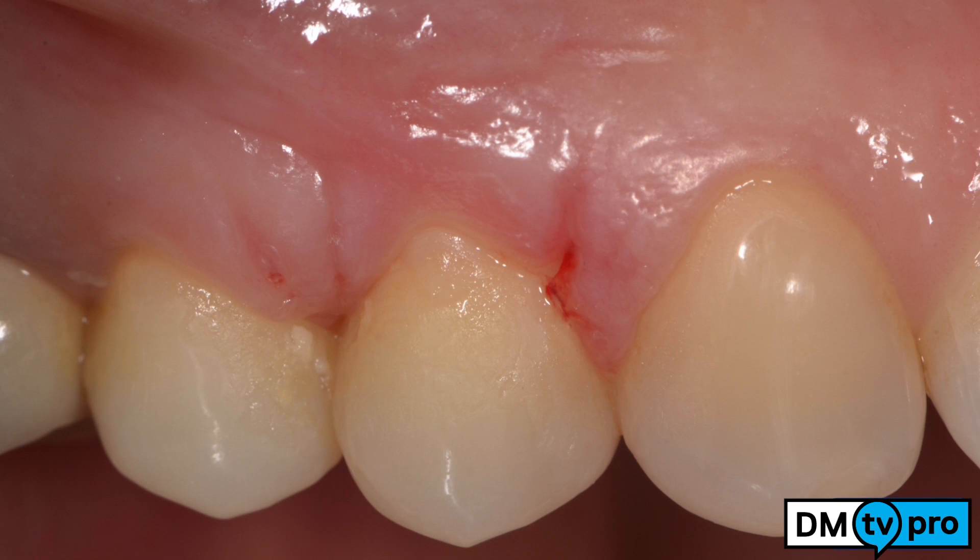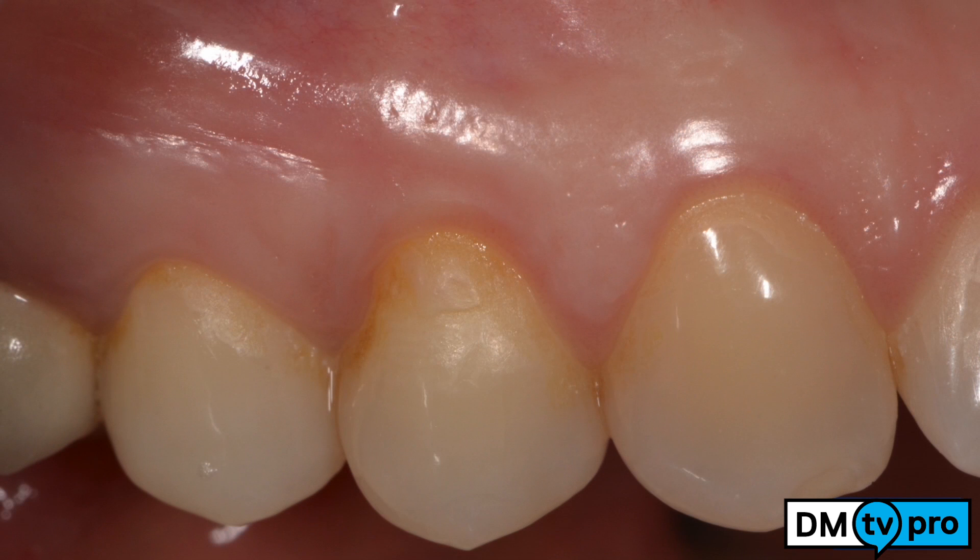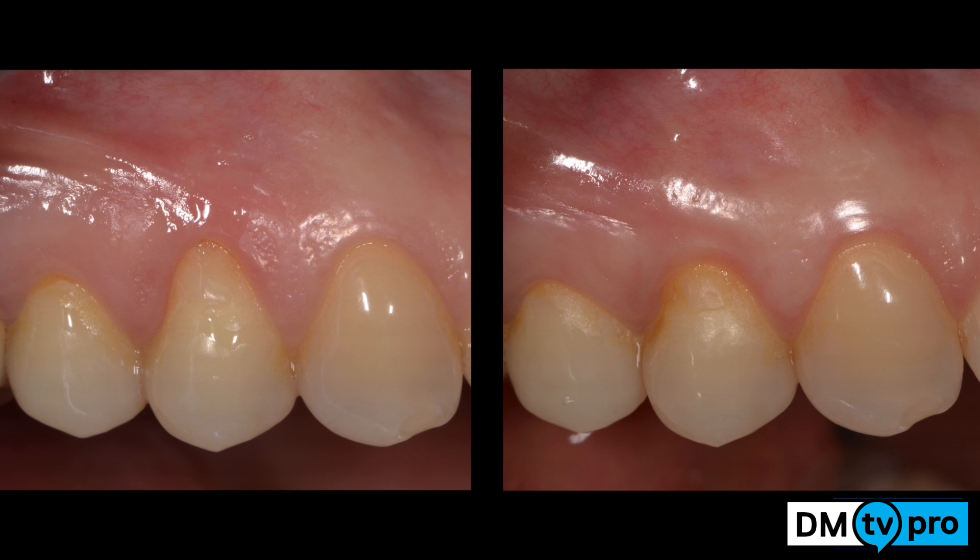At 10 days after suture removal, a nice root coverage has been accomplished. After one month the results are good, and after 6 months the position of the gingival margin is well established and the soft tissue thickness has been improved.